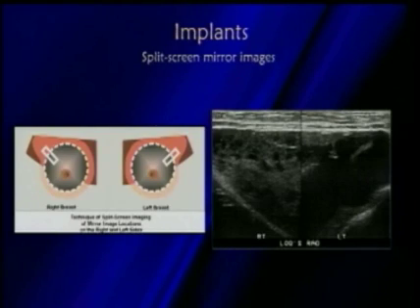Now, very important, once you've seen a patient that has intracapsular rupture, or you're evaluating these, there are just sort of silicone granulations that we can see within this patient that has this intracapsular rupture, so different appearances that we can see in evaluating that. Once we see that, you kind of want to scan around the periphery. When we can tell that a patient has intracapsular rupture, then the key to what we're looking for is, is there any extravasation?